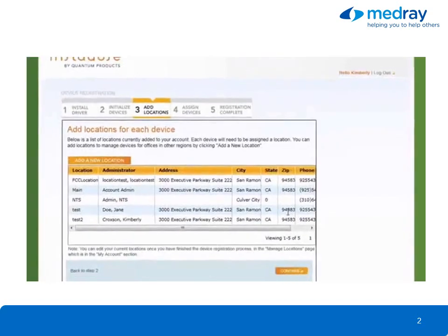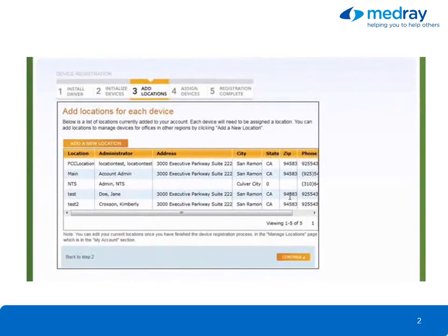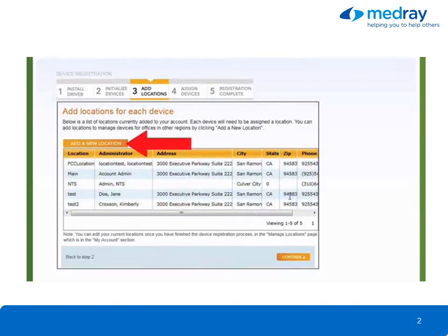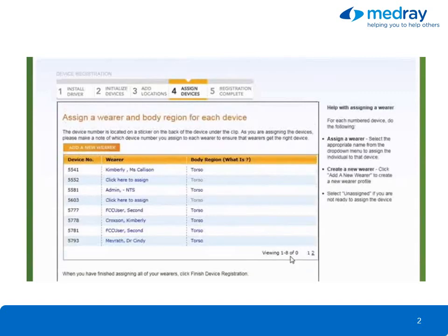The next step allows you to add locations to your account. The locations currently associated with your account are displayed. You can create a new location to manage devices for offices in other regions by clicking Add New Location. If you don't need to create a new location, click Continue to proceed to Assign Devices.